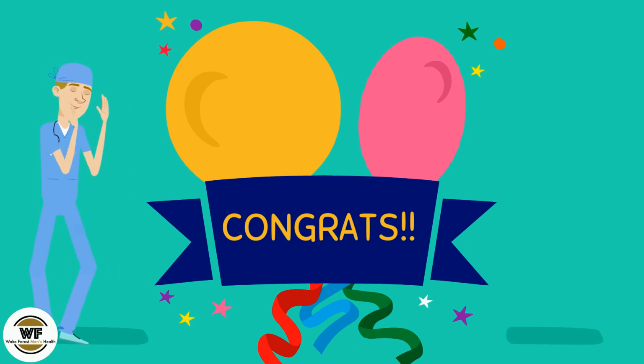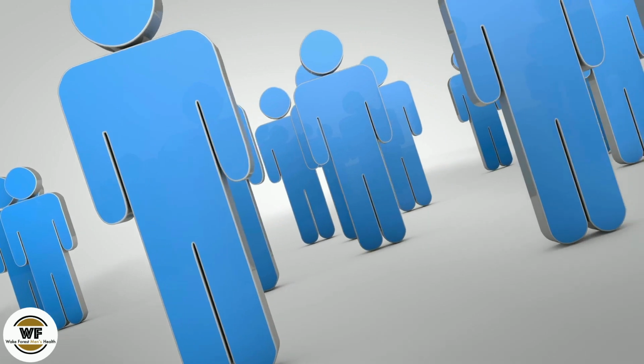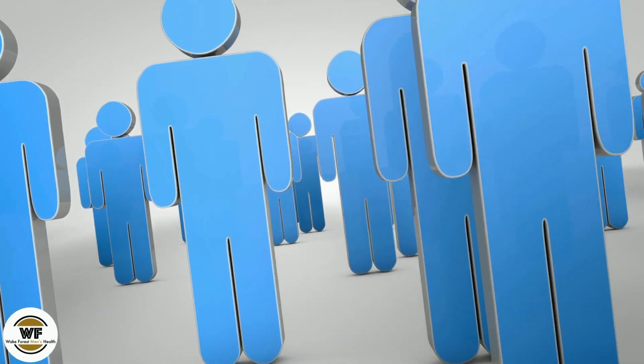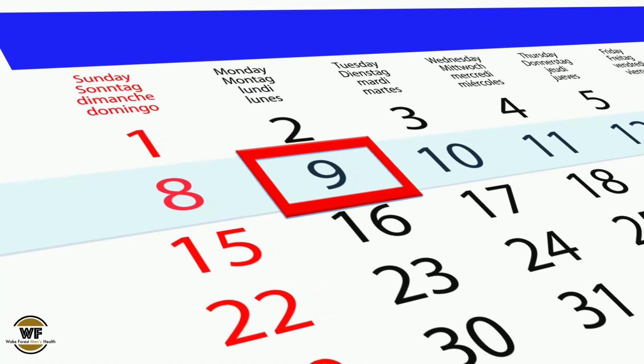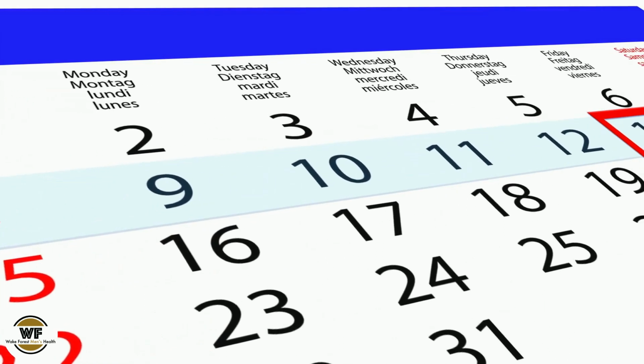Congratulations on taking a big step to improve your quality of life. You've now joined the tens of thousands of men who have chosen to reclaim their sexual function by receiving a penile implant. Now that you've waited the customary 6 weeks, the time has come to start using the implant.